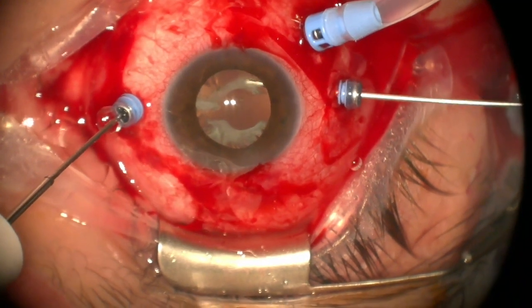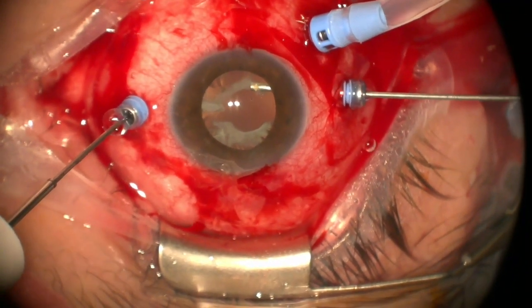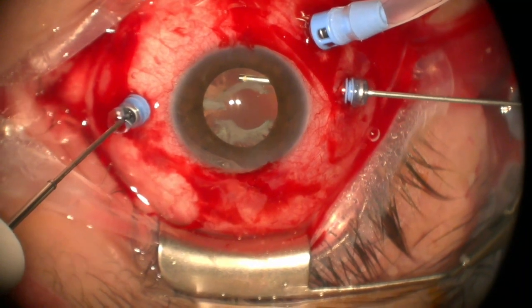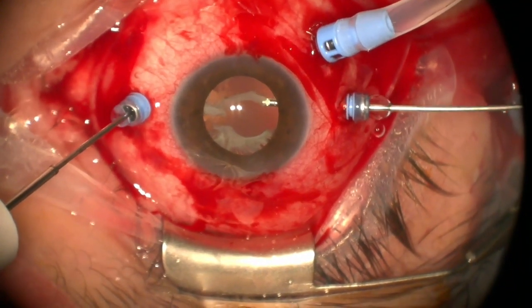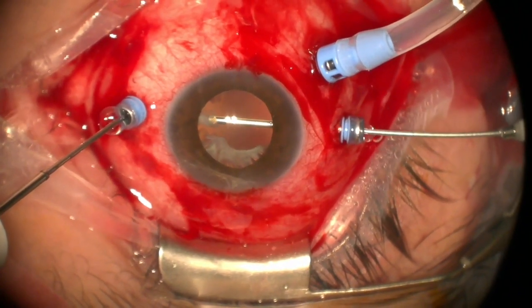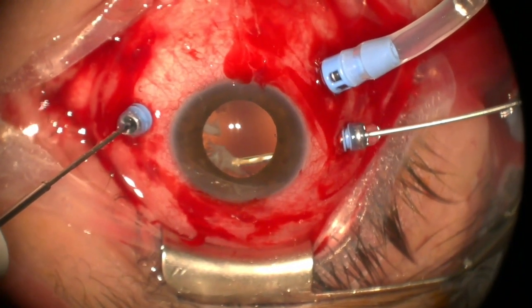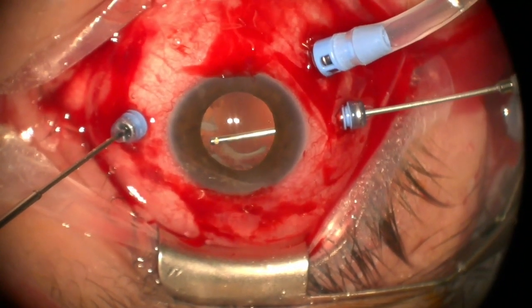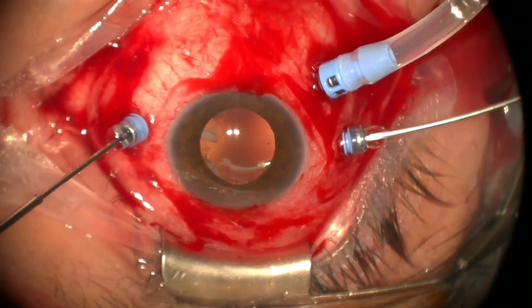Again, in a case like this, whether the capsule is left at all or not is debatable. You know, you could even just remove it entirely. And what I'm going to do is just cut around the capsule, the fibrotic part, that is. And there we go. It doesn't take much capsule support. As long as it's in the periphery, you still have a chance of a sulcus IOL. So I'm not too worried about this opening.